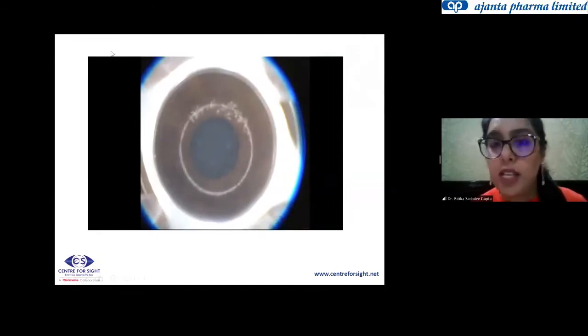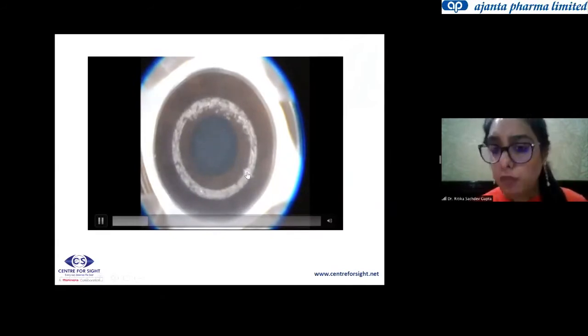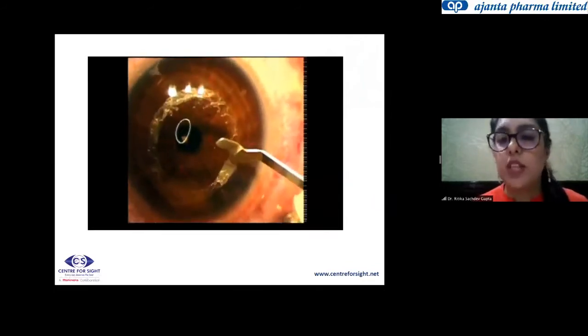However, with the femto laser, this technique has become more popular because complications have reduced significantly. This is the tunnel for the ICRS being created by the femto laser, and this is the deep cut which will allow you to implant the ICRS. Like with all femto lasers, there are some tissue bridges that you need to cleave.